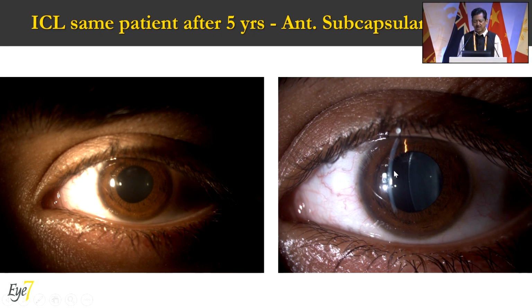And look at on a slit lamp, this is how it looked in the periphery. Now we were wondering, it was new to us, right in the beginning, say 15, 20 years back when we started these lenses, and we really didn't know what to do, and there were not many people to guide us. Still, everybody said that now that there's a cataract, you have to do a cataract surgery, so might as well wait and see what happens.